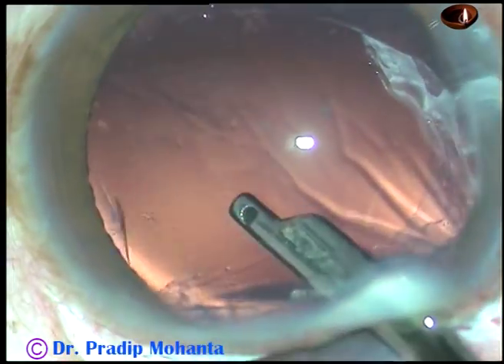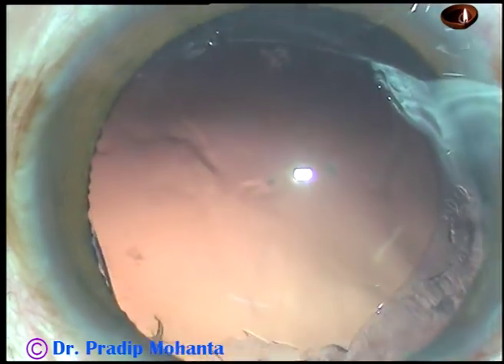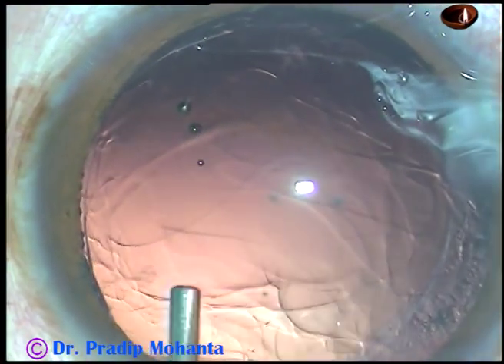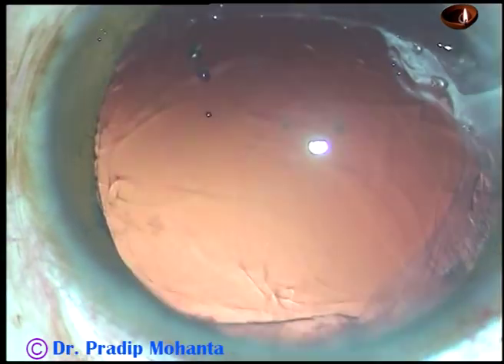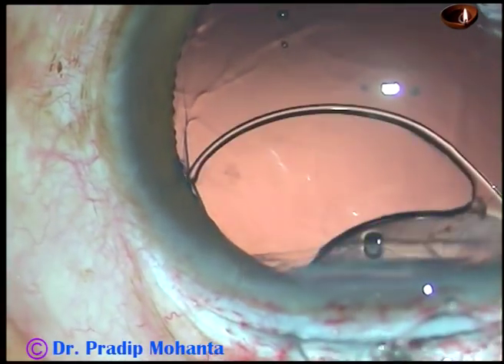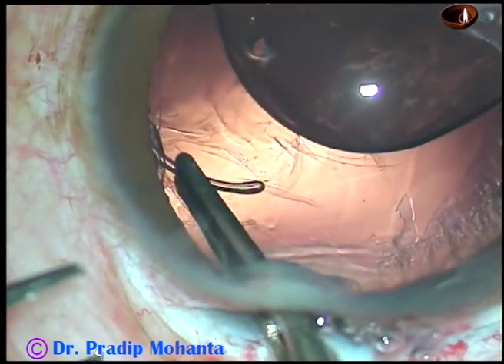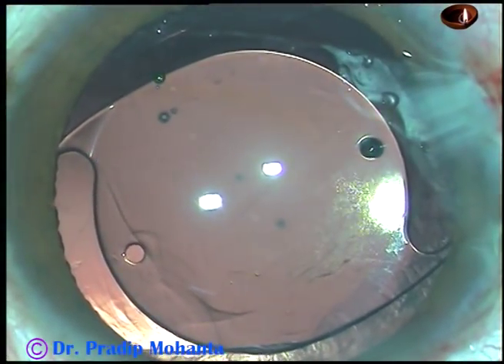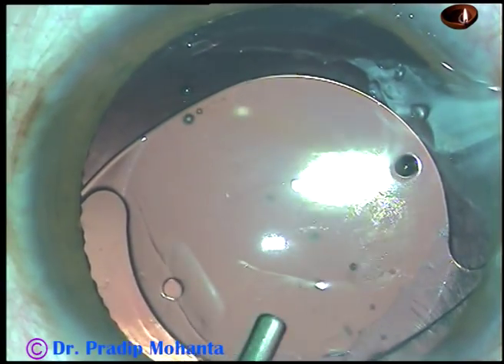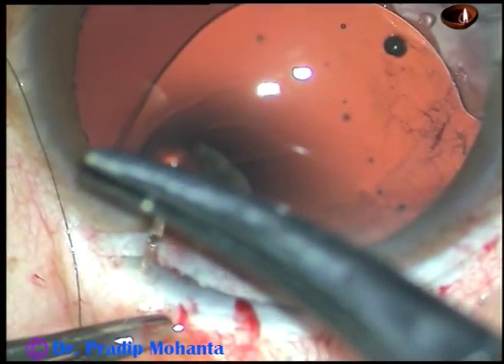You can see the capsular tags. The can opener rhexis has given way at around 3 o'clock. Now inject viscoelastic substance. Take the rigid 6 mm optic intraocular lens — a PMMA lens. Hold it with McPherson's forceps and place it in the capsular bag, behind the rim of the anterior capsule. If you place it in the sulcus, that is also not a problem.